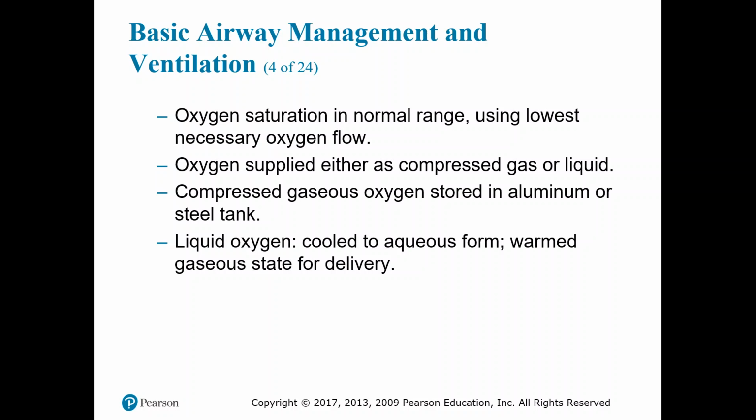The same would be for the E cylinder, except your tank pressure times 0.28 divided by liters per minute. And the M cylinder would be your pressure times 1.56 divided by liters per minute. Now, those are your gaseous oxygen storage that's most common. There are a few ambulance services out there that on their ambulances are using liquid oxygen storage systems, and those are a little bit different.